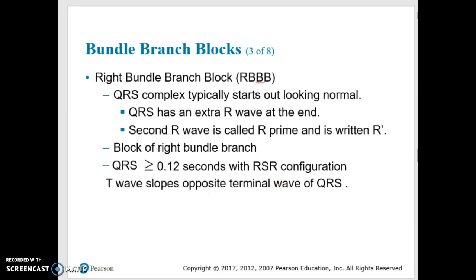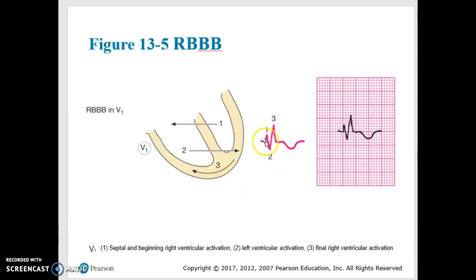So let's move to this and take a peek. You have the PQRS, you have your P, you can't see that, and then you have your QRS, and then you see we have this third R. That's what we're talking about, an R on R. But take a look at this. The T wave is dipping downward.